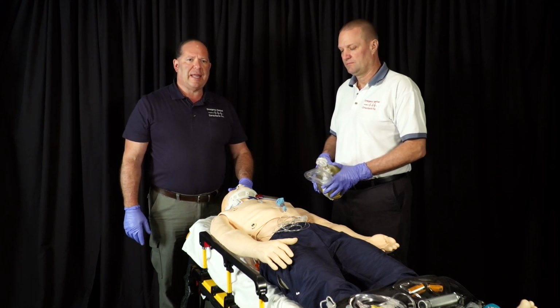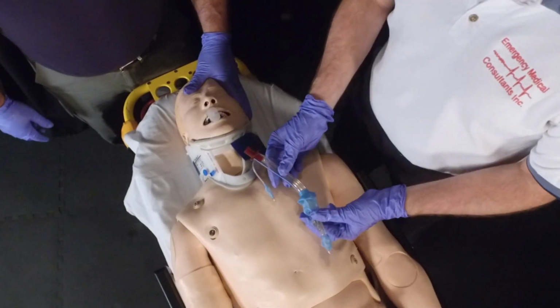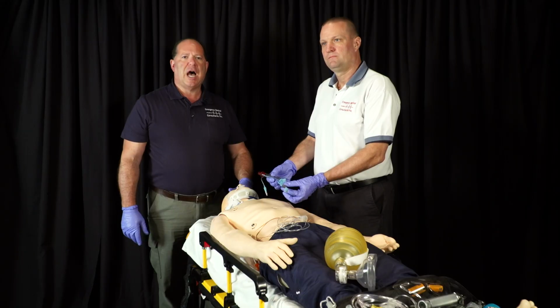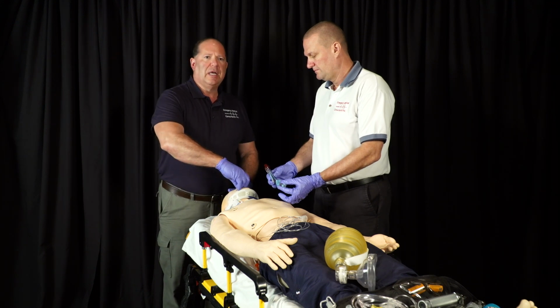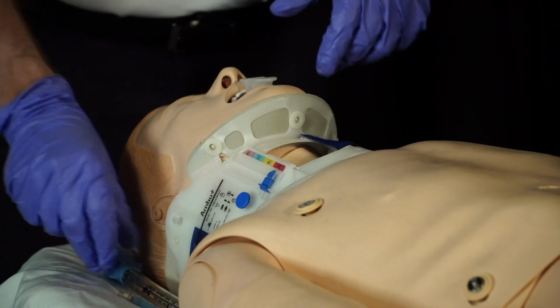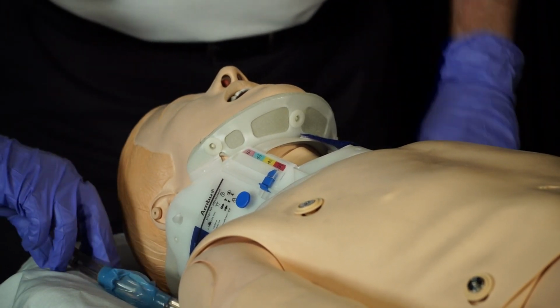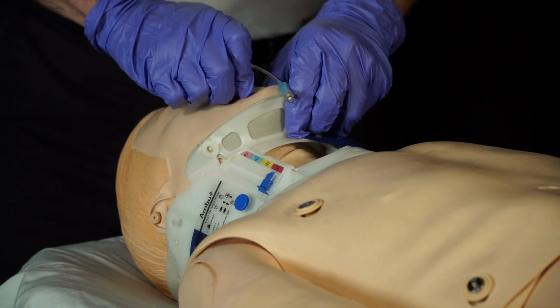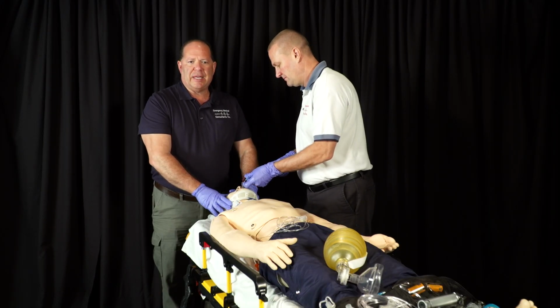The next device we'll look at is the King Airway. The King Airway is a double cuffed device that again is measured by the patient's height and placed in without having to move the patient's C-spine, and it's again another esophageal type device or paralaryngeal device. So the spine can remain neutral. The device is put in based on the patient's size and put into the esophagus. The tip of it sits in the esophagus. Again, quick and simple, inflated.